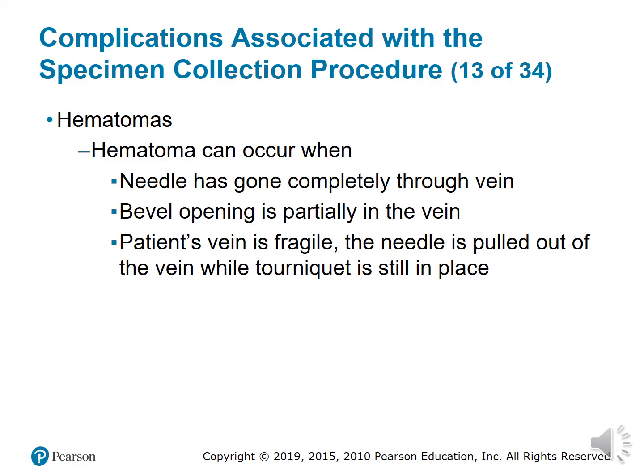Hematomas, they happen. Even the best phlebotomist can cause someone to get a hematoma. We try not to. That is the one thing we try not to do, but it does happen. It's not the improper way of you drawing all the time. It's just sometimes their skin is just so fragile.